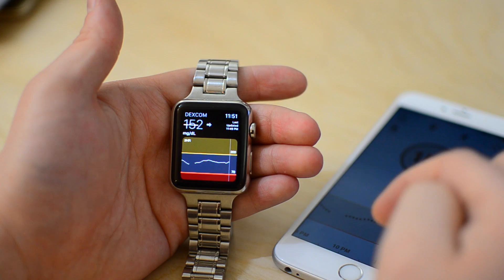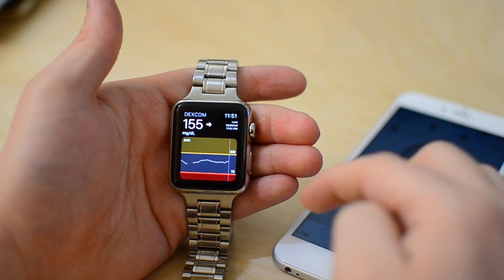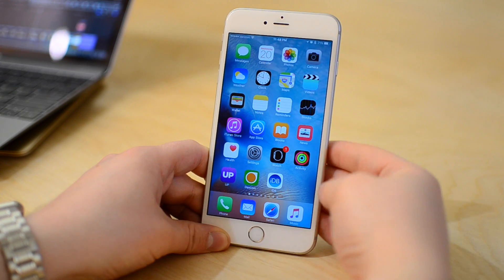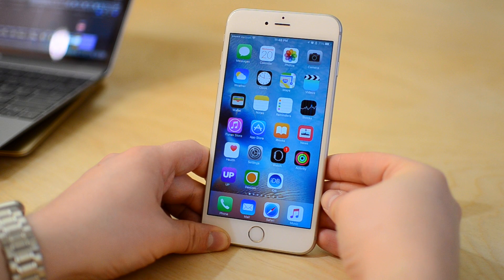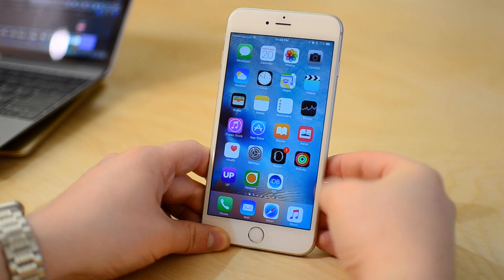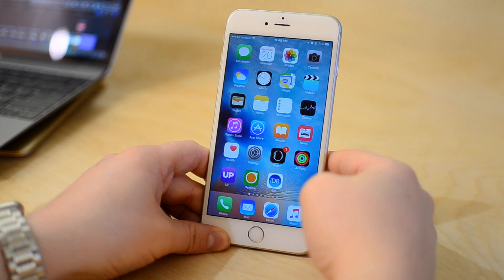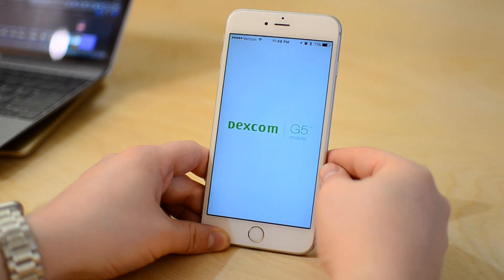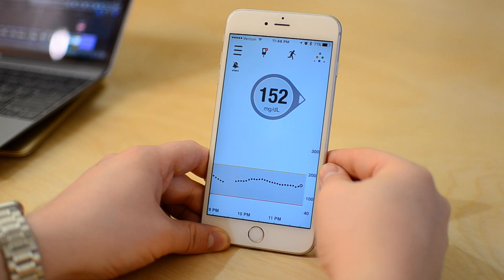Hey everyone, it's Andrew here from MAOMagic. I'm here with the new version of the Dexcom G5 application. Now the Dexcom G5 can go straight to your phone — no receiver necessary.